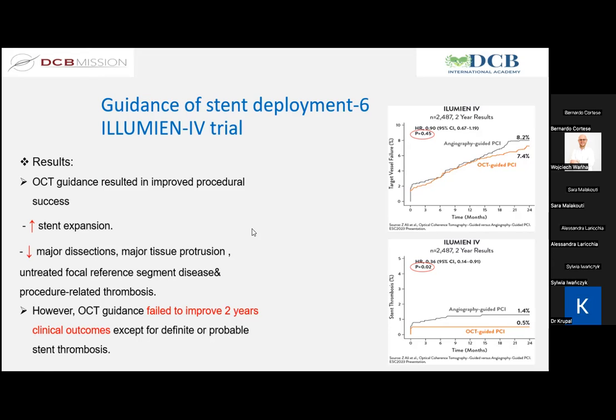The clinical outcome was low in all groups. So I think the low event rate couldn't differentiate between the improved outcome with OCT versus angio guidance. One interpretation could be that this is a sort of all-comer study which aimed to see if there is a role of OCT in an all-comer population, because this is not a very selected population.